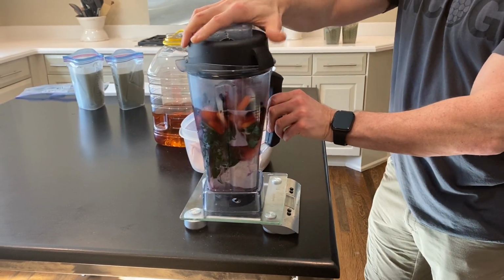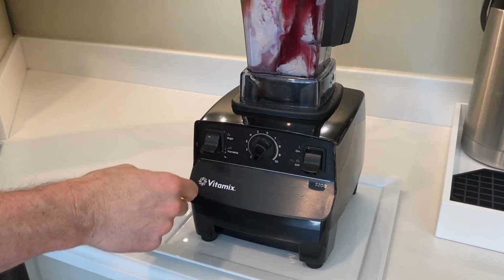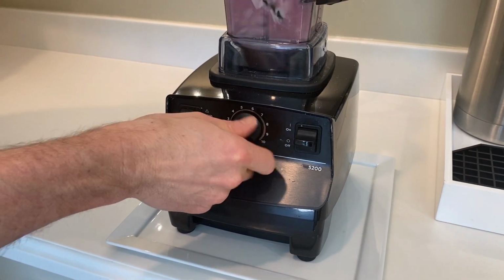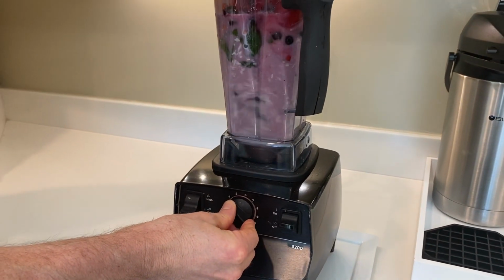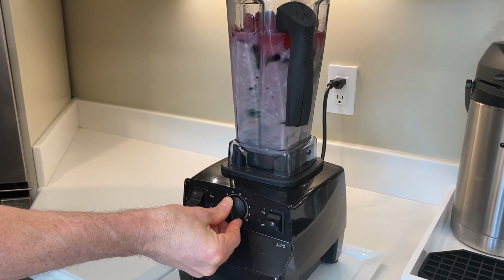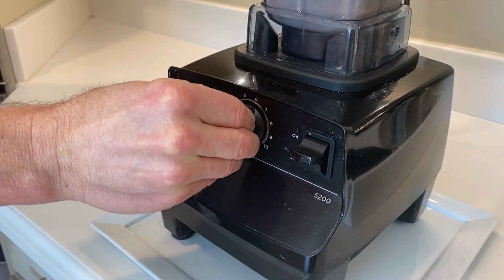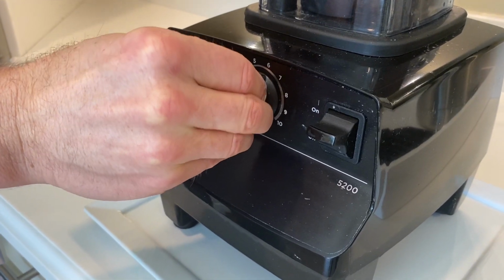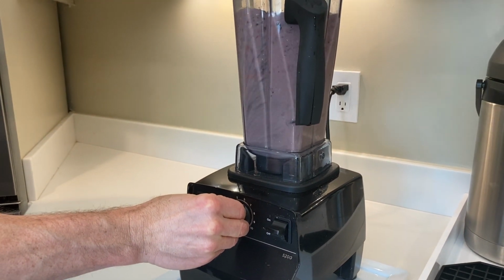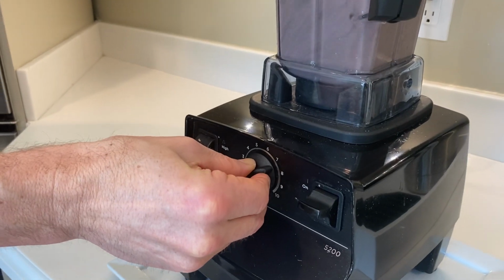Now we place the pitcher on the mixer. The user interface has three controls: the left, middle, and right. First, you flip the on-off button, then you move the middle dial very slowly until you can see the blend consistently blending throughout the blender. If you don't see that consistent movement, you'll want to stop and add a little bit more liquid. We turn the variable speed up until we can see consistent movement throughout the entire pitcher.